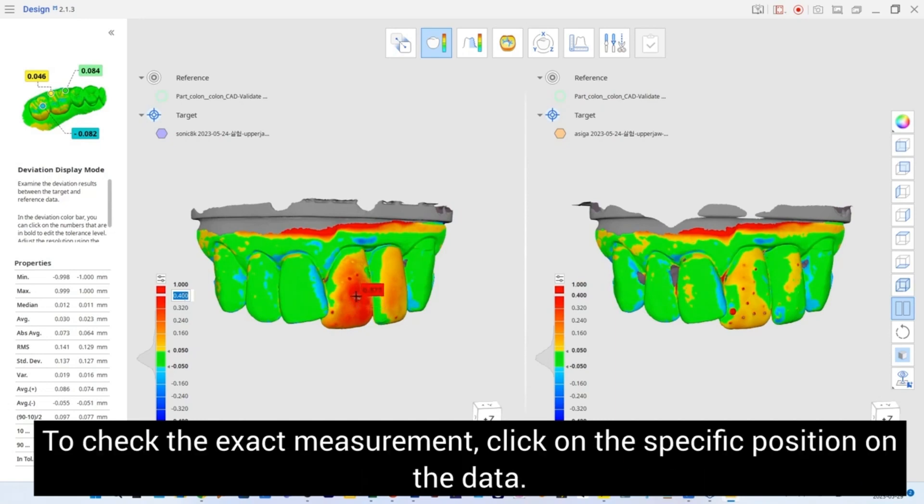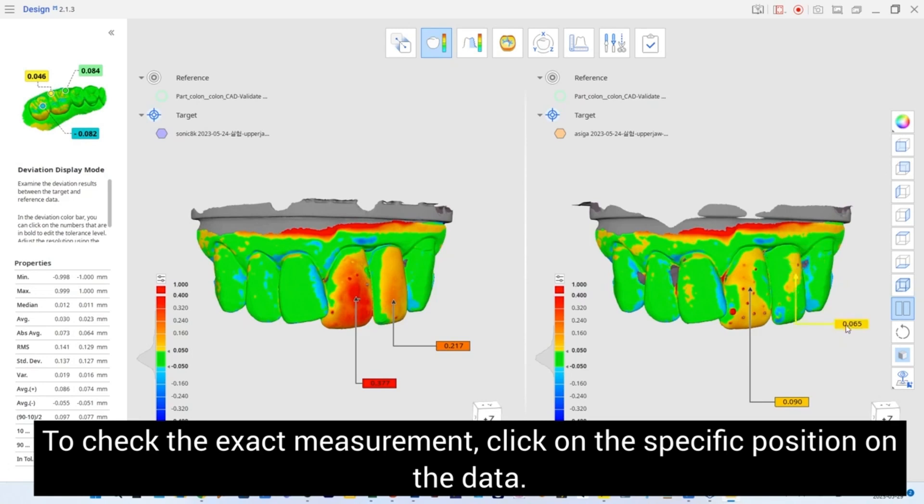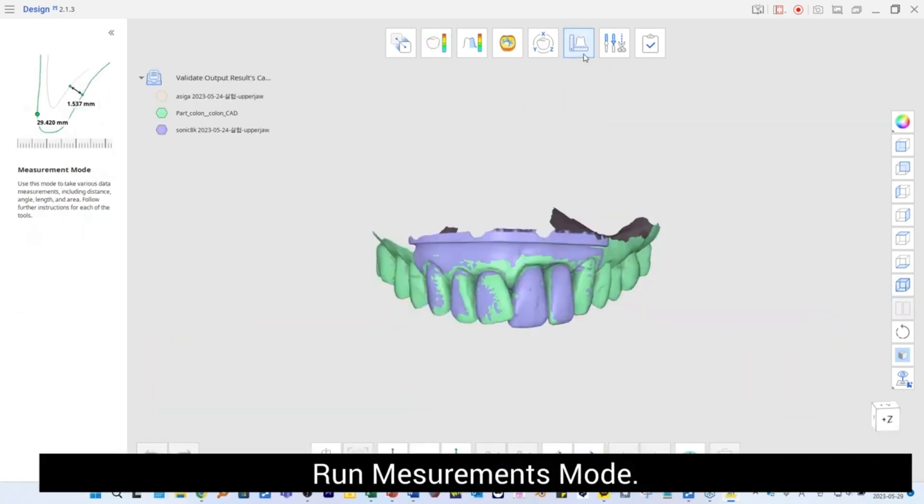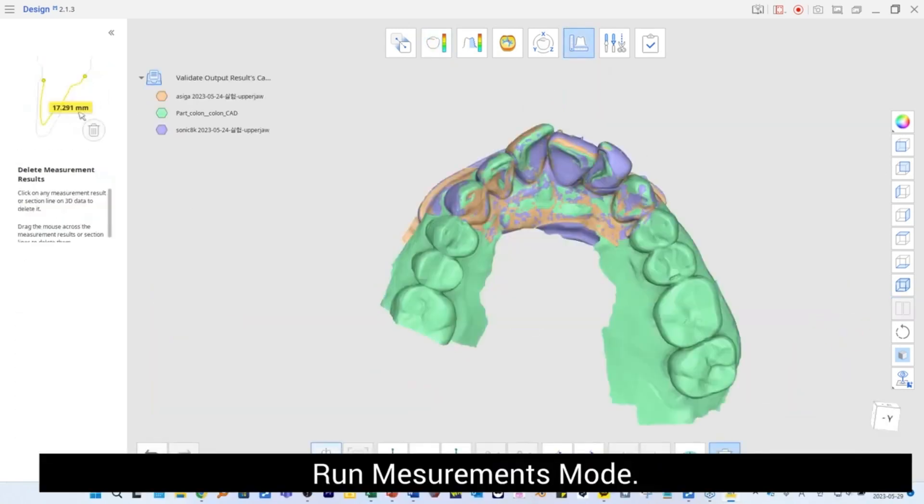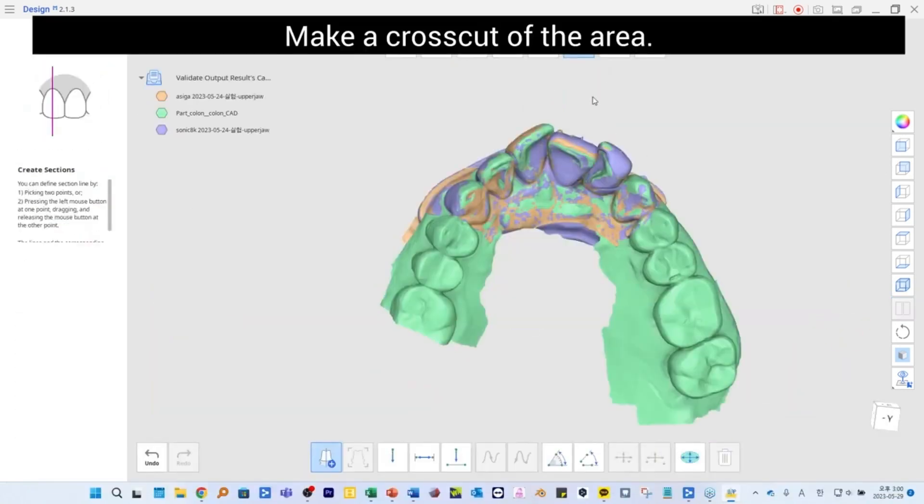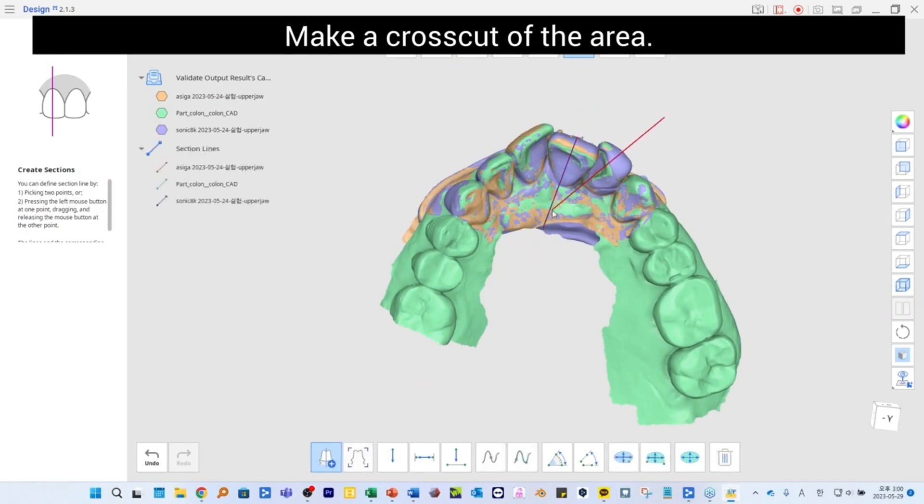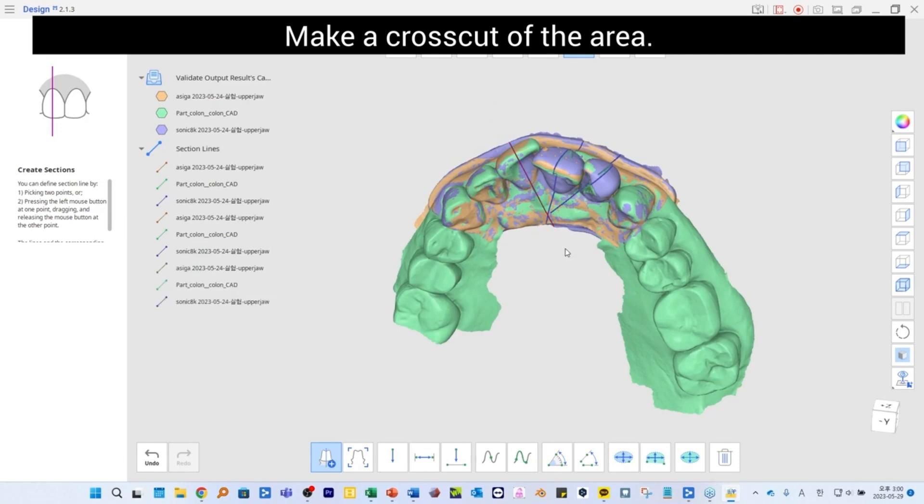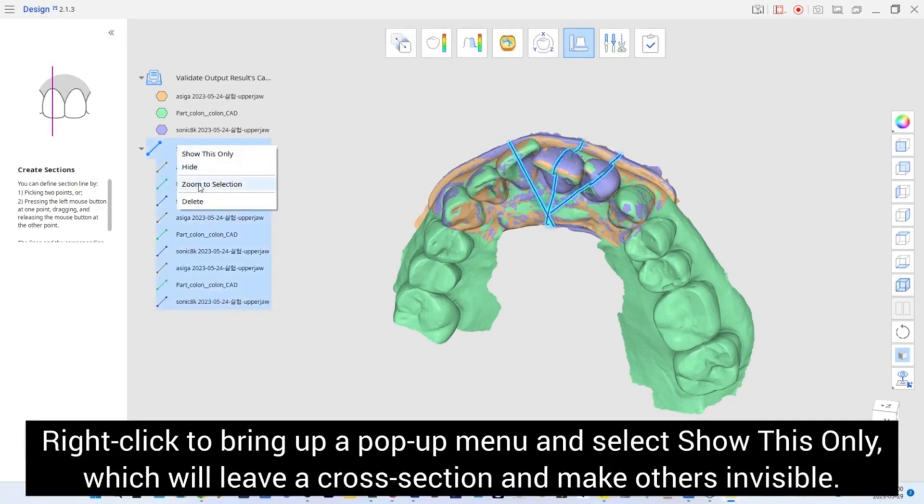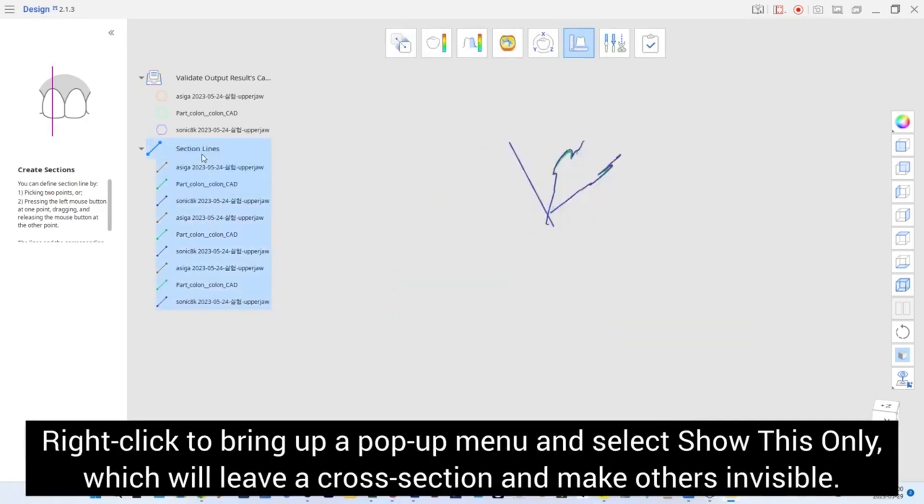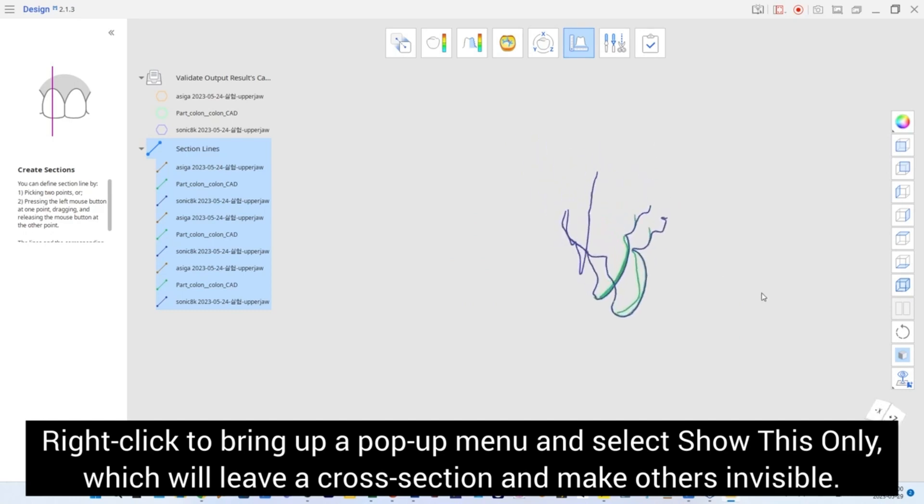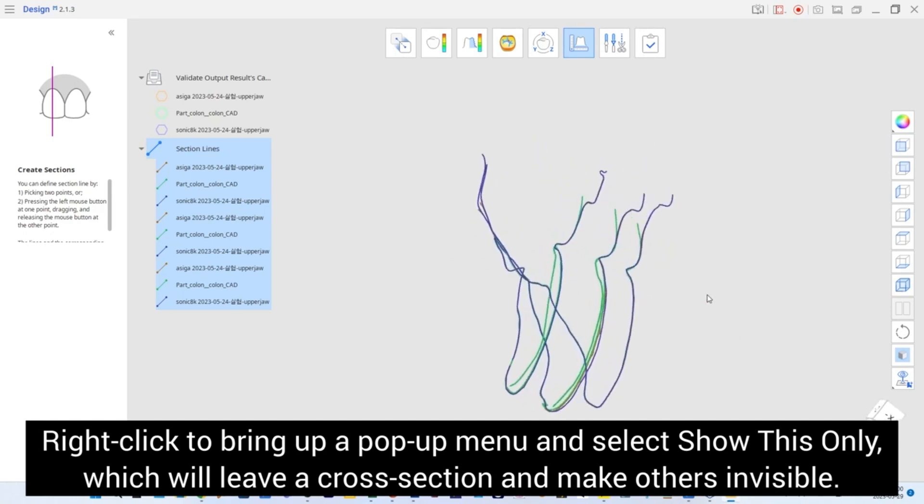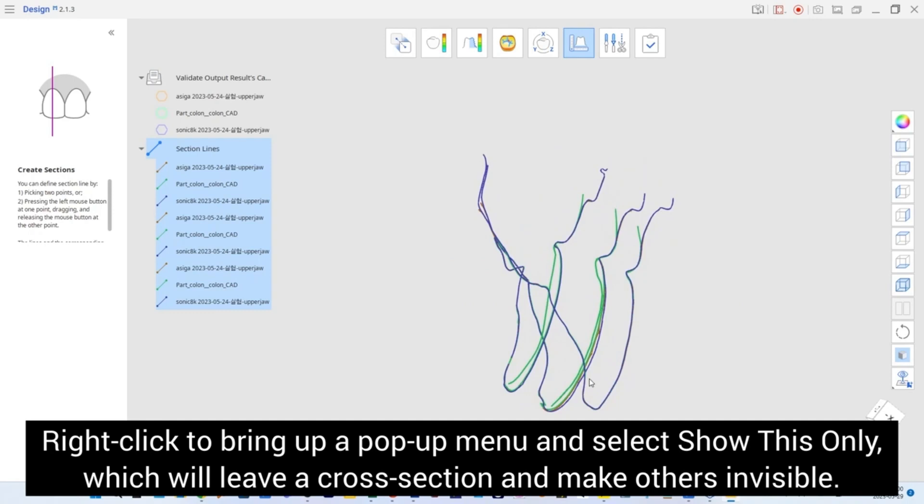To check the exact measurement, click on the specific position on the data. Run Measurement mode and make a cross-cut of the area. Right-click to bring up a pop-up menu and select Show this only, which will leave a cross-section and make others invisible.